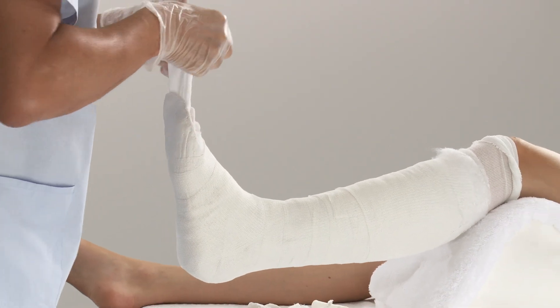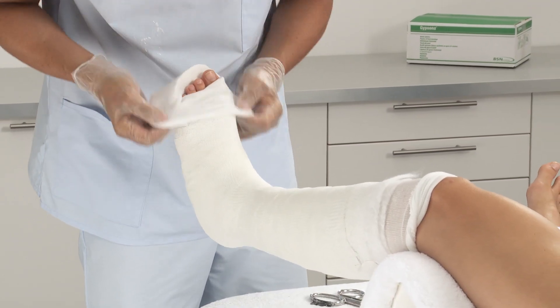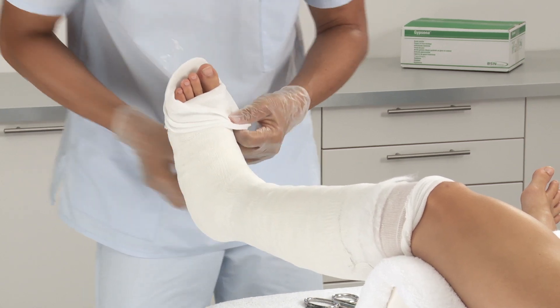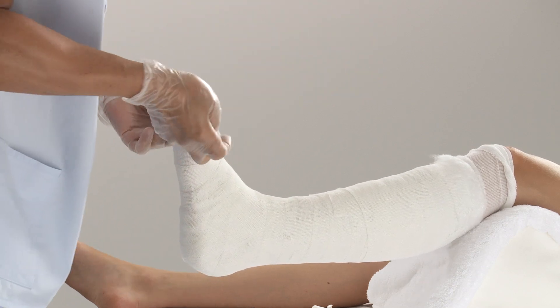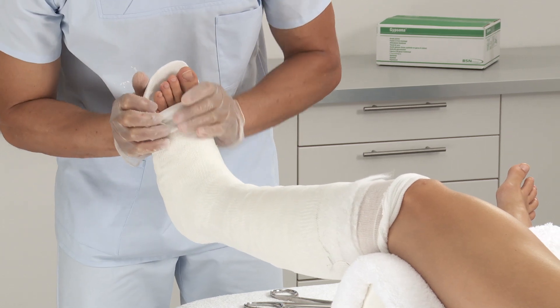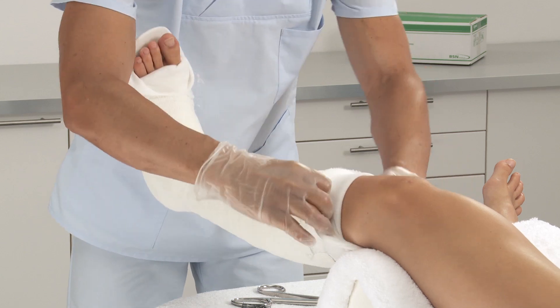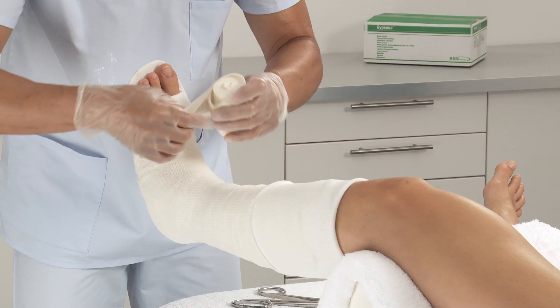Pull out the stockinette at the distal end and fold over. Trim any excess. Fold down the stockinette at the proximal end. Smooth edges provide skin protection and comfort.